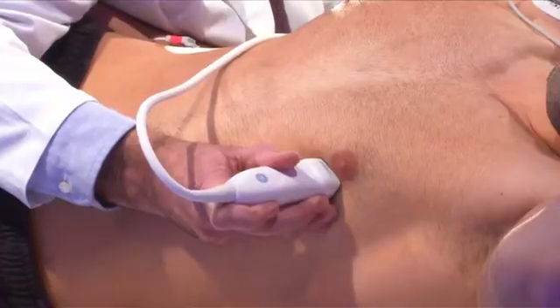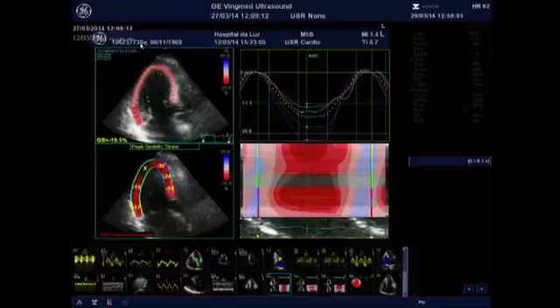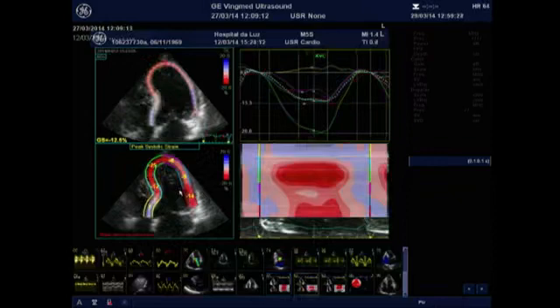Another approach to systolic function would be speckle tracking echocardiography in the apical view. Here is the 3-chamber view. One segment was not clear for analysis, and I'm going to exclude it in the assessment. In this view, only one segment, the basal segment of the anterior septum, is mildly abnormal. -14 is a borderline value, but when we change to the 4-chamber view, we can see very important and interesting findings.